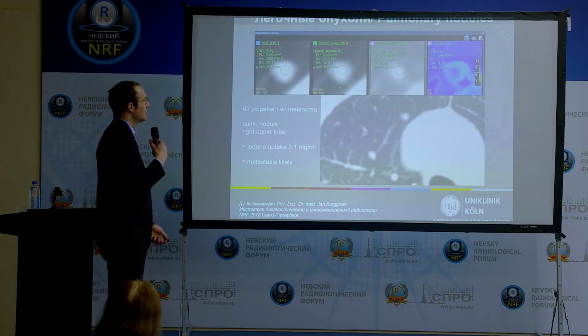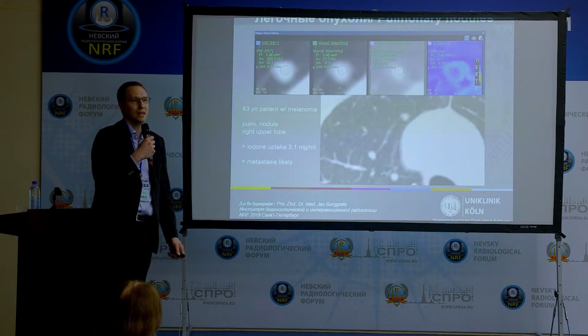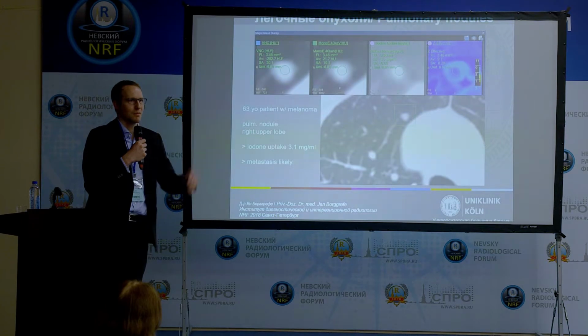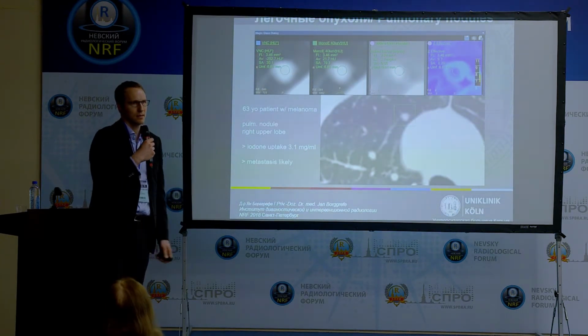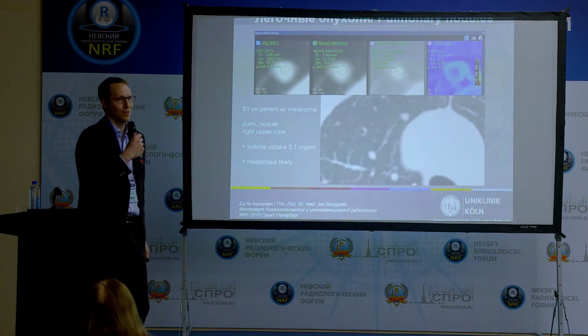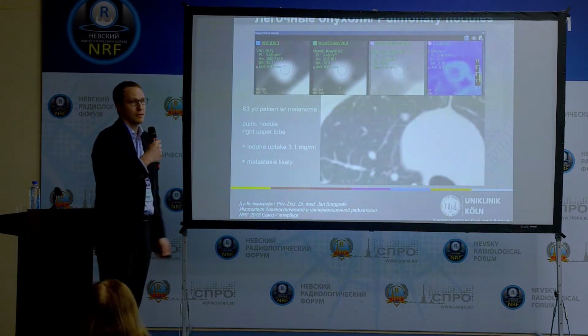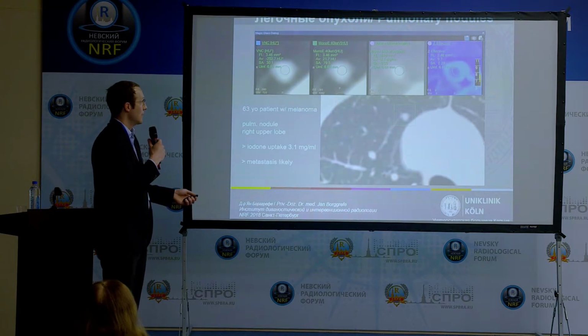And it helps in these cases a lot to have the iodine density, because it says that here it has an iodine density of over 3 milligrams per milliliter. The threshold might be about 2 milligrams per milliliter to have a specific saying that this is suspicious for a malignant lesion. And this helped us a lot in order to say this has to be biopsied, and this was then done with an open resection of the lesion.